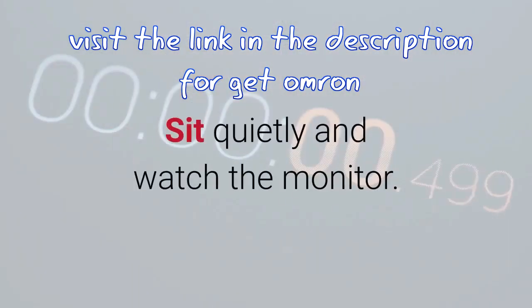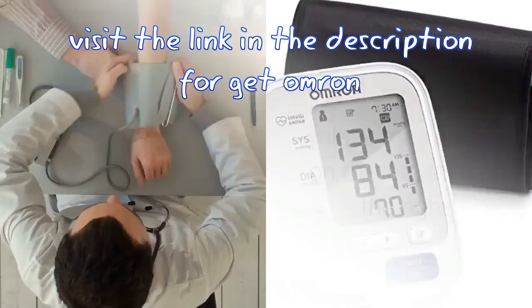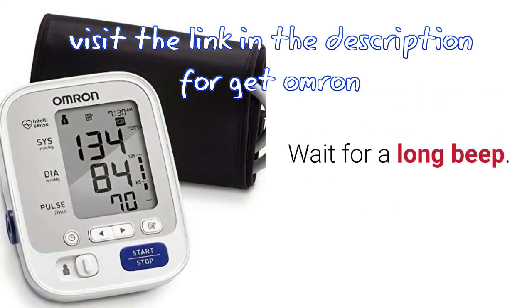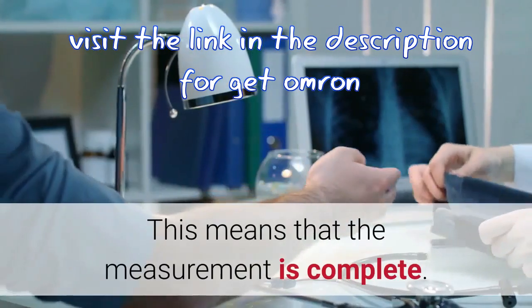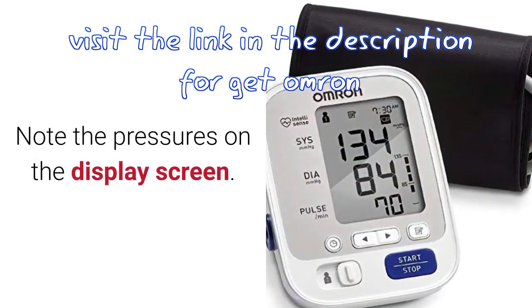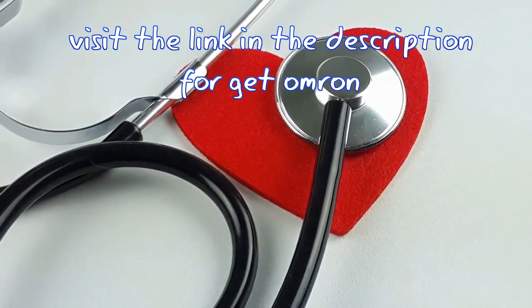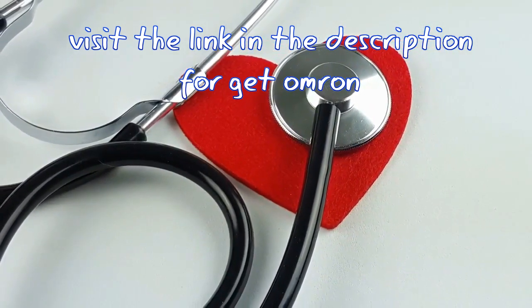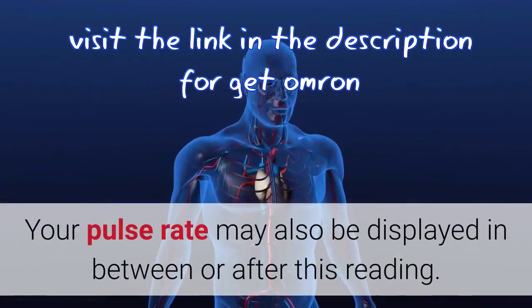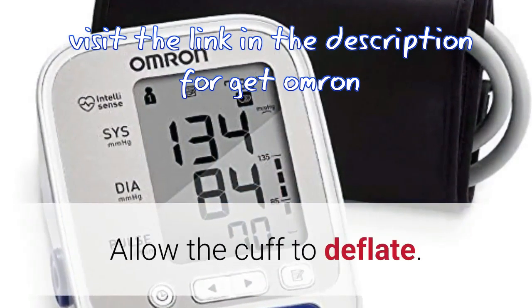Sit quietly and watch the monitor. Pressure readings will be displayed on the screen. For some devices, values may appear on the left then on the right. Wait for a long beep — this means the measurement is complete. Note the pressures on the display: systolic pressure, the force of blood against the artery walls as your heart beats, appears on the left; diastolic pressure, the blood pressure between heartbeats, appears on the right. Your pulse rate may also be displayed. Allow the cuff to deflate.